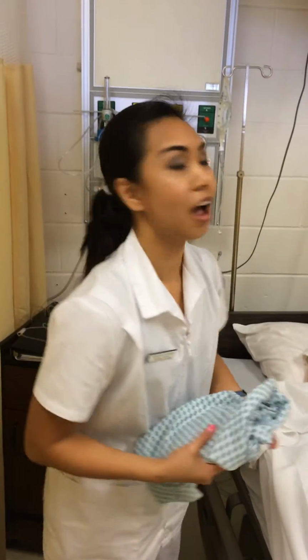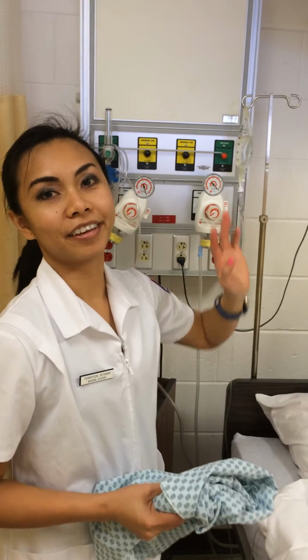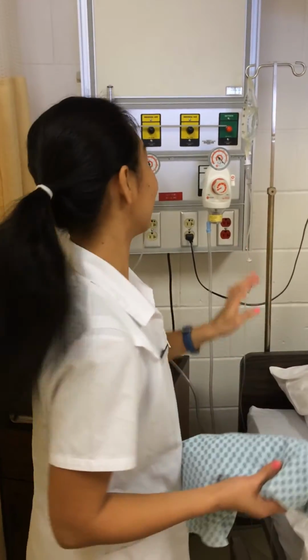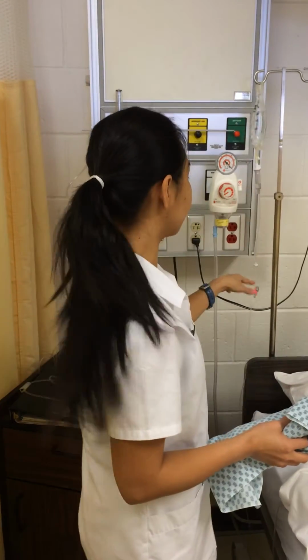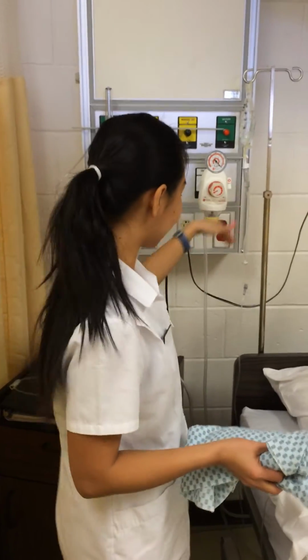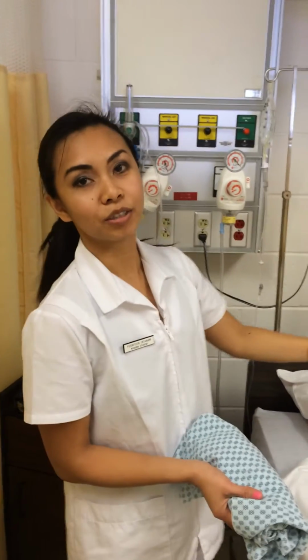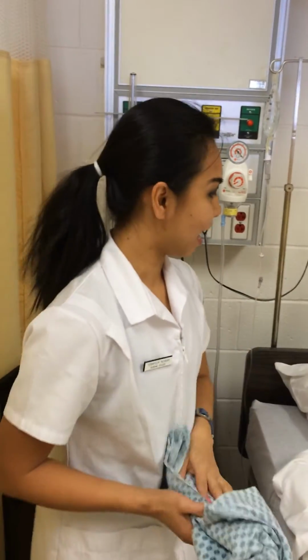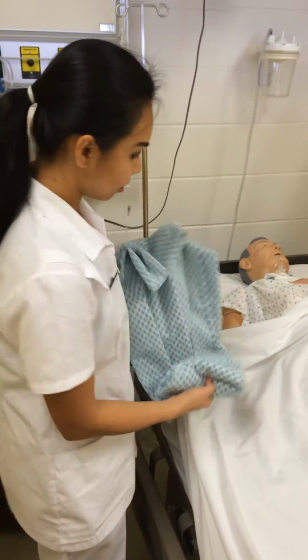Oh, I'm sorry. When I do the IVPB bag, I need to lower the primary bag down so that the IVPB bag can start to go to the patient. I just fixed that. So coming back, I'm going to change the gown for the patient.